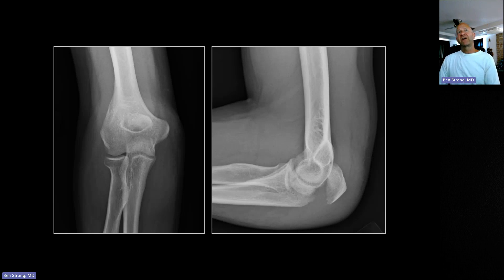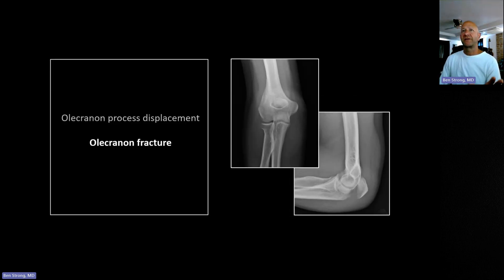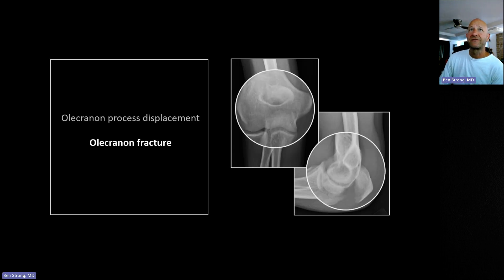Those are important findings because a lot of other elbow fractures can be really subtle, and that can be the only finding you see. On the frontal view you can see the olecranon sitting over the olecranon fossa of the distal humerus.